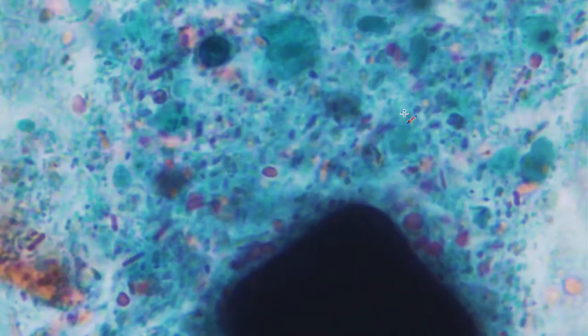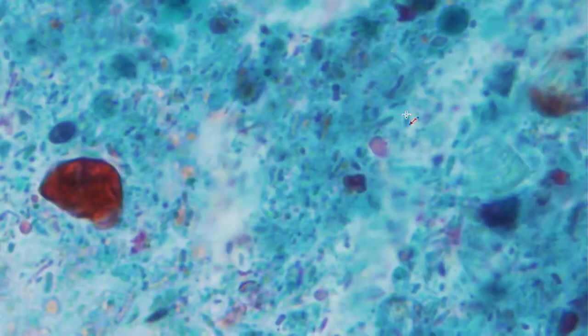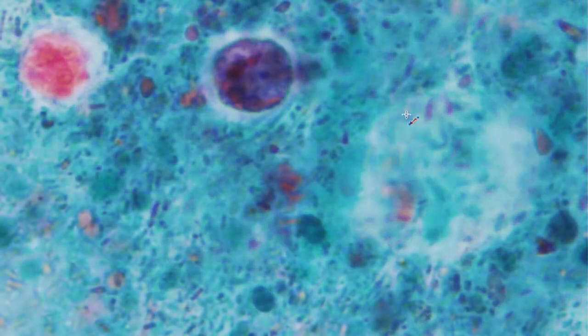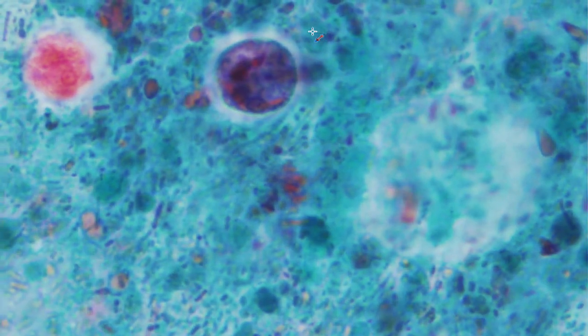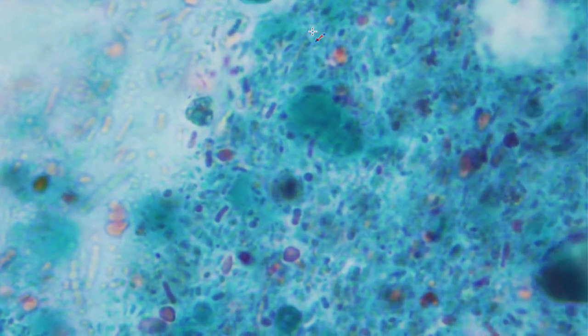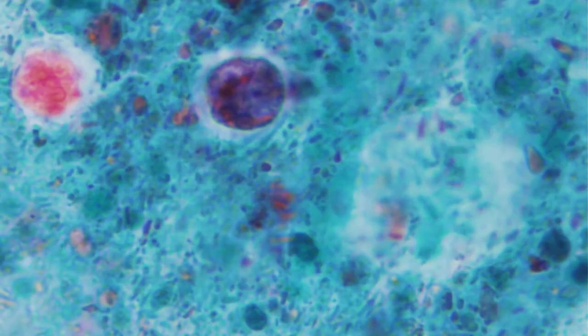So let's have a look at some nice, lovely cysts in here and have a look at their morphology and describe for you what we can see. I'm trying to find some here which haven't actually got stained red. So here we have a nice cyst. I'm just going to move it to the center for you. I've lost it, and we'll bring it back. Okay. We'll try and just zoom in a little bit on that.